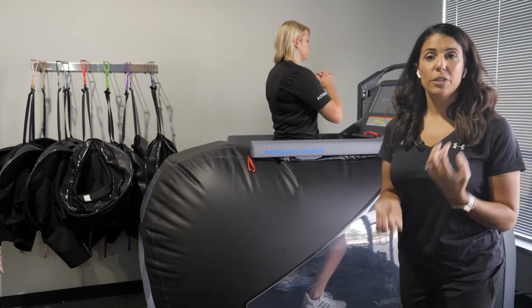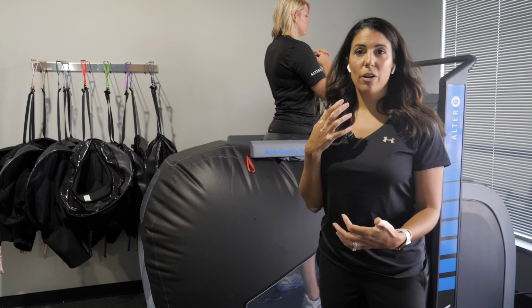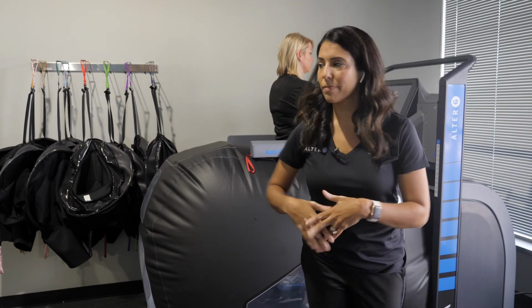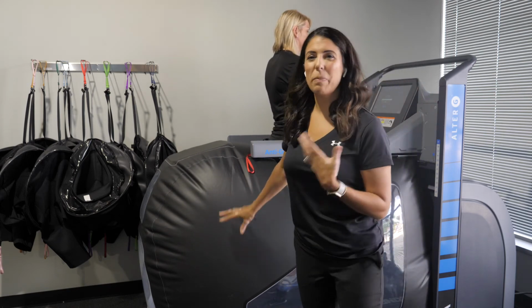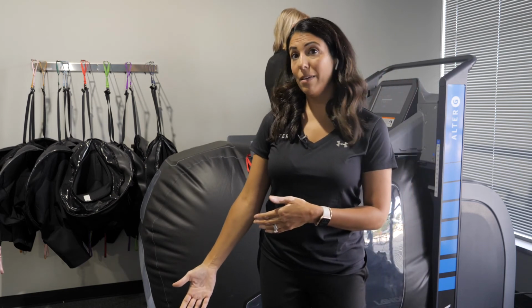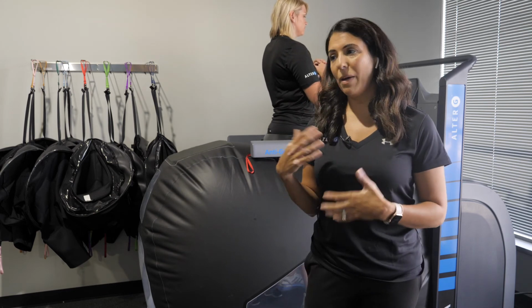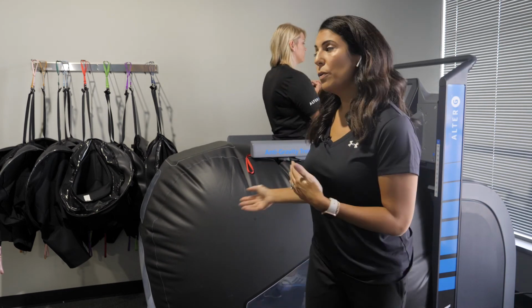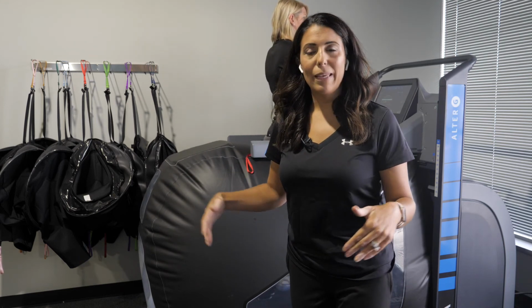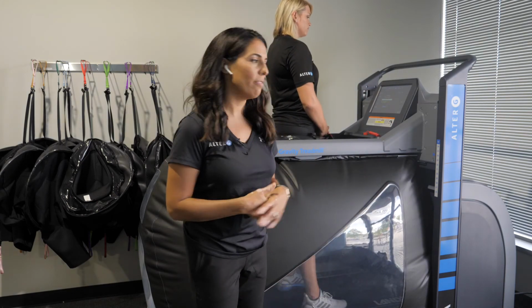are going to, again, reduce the load on the joint and actually help that eccentric movement. Remember that our cardiovascular system works harder with eccentric exercise. So if we need some of this body weight support to make that exercise a little bit easier, so maybe somebody can't do any of them over ground, or maybe 2 or 3 and then their form starts to be off, they might be at risk for injury or for falls. Within the treadmill, they can do these really important strengthening activities with a fall-safe environment and using that body weight support for a little bit of assistance to be able to do more of them.